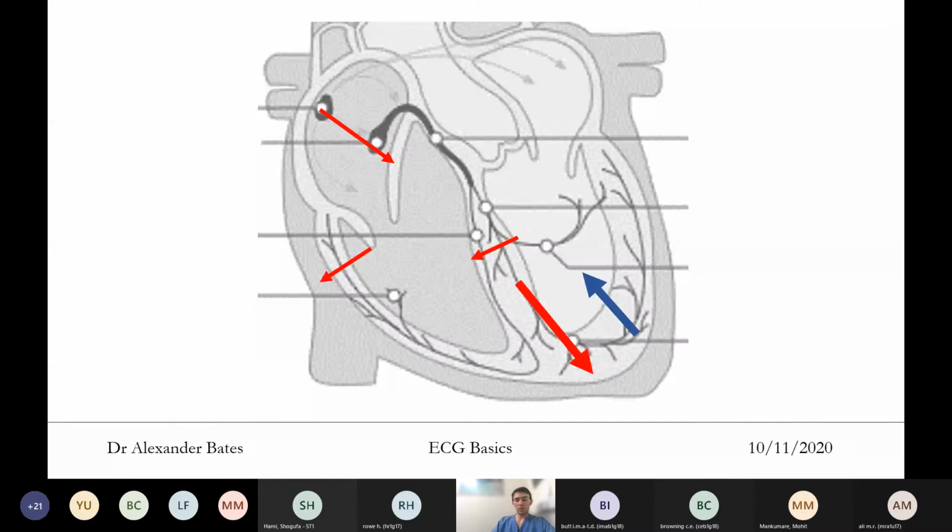Coming back here, I also mentioned dynamicism. So what do we mean by that? Well, what we mean is that if you take a series of ECGs 10 minutes apart, then you will see changes between the two, or 2, 3, 4, 5. Why is that useful? If you're seeing dynamic changes on the ECG and not fixed changes, that means there is ongoing ischemia. And why is that?